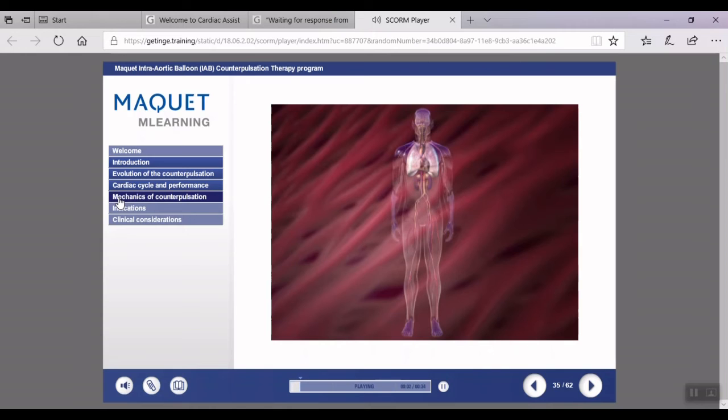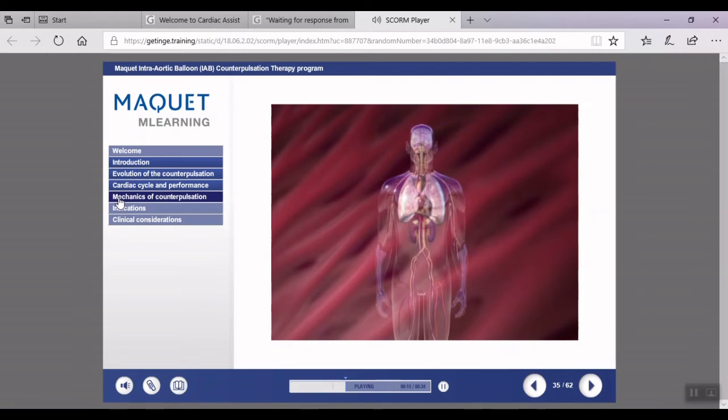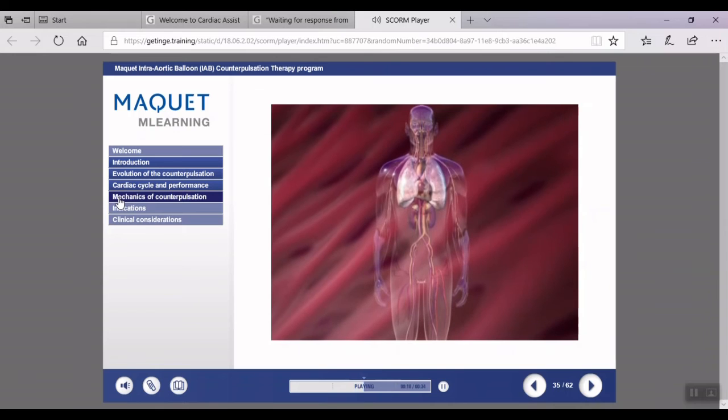The systemic effects of intra-aortic balloon counterpulsation can be assessed in the nervous, renal, vascular, and respiratory systems. Improvement in cerebral perfusion enhances the patient's level of consciousness. Urine output increases due to improved renal perfusion. The increase in cardiac output augments peripheral perfusion and may be evidenced by skin that is warm and pink. And, as cardiac output increases, respiratory status improves.